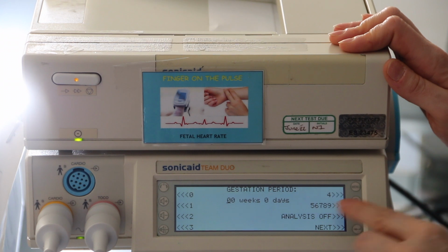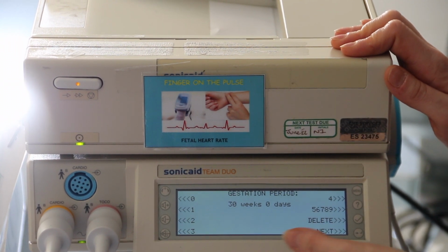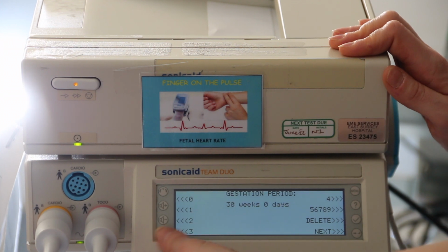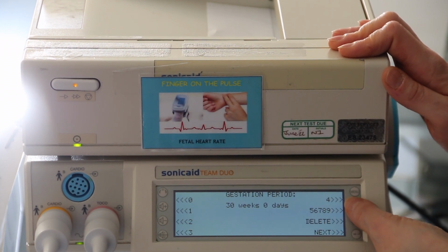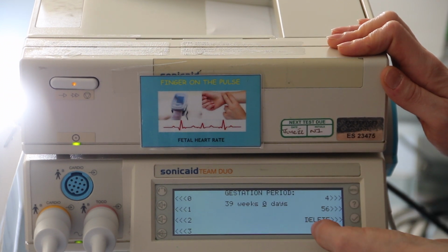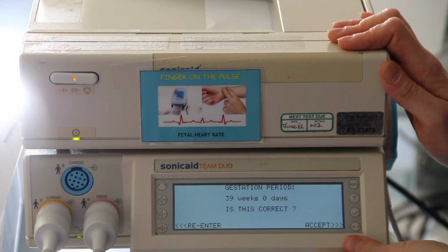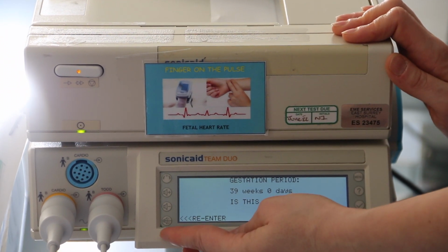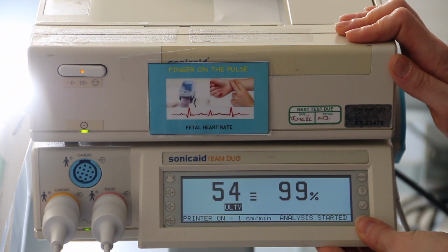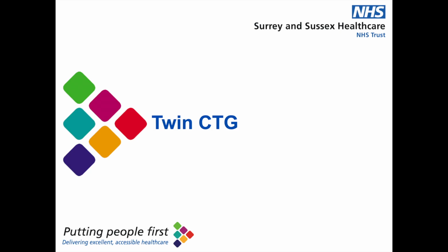You have a choice of weeks here, so we're going to press 3 for 30 weeks, and then you can add the number of weeks. So in this case we're going to press our 5 to 9 button and choose 9, and we're going to choose 39 weeks, press next, and it will ask you, is this correct? If it's not, you can re-enter. If it is, you accept, and then the Dawes-Redman analysis will start.